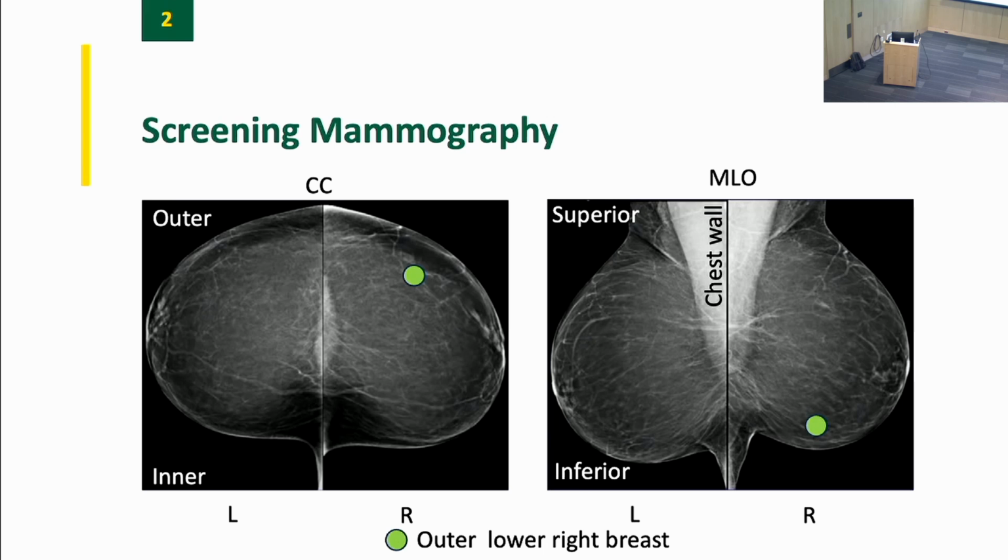for certain scanners. You could take a cohort of maybe just a couple thousand mammograms and label them with their manufacturer, GE, Toshiba, Siemens, and train a model to detect what scanner it was, and it would do a very good job. There's this imperceptible fingerprint in the images that we don't know how to eliminate, essentially.